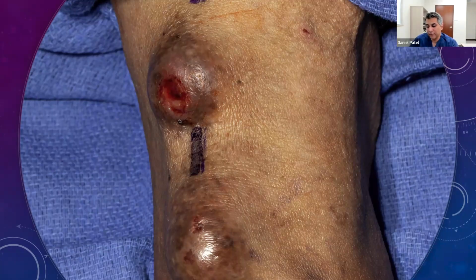We look for thinning of the skin. Can you pull skin up over that ulcer? If you can't, and it's very thin, that's when you really need to have that patient seen with your interventionalist or your surgeon to maybe consider a revision of it. And it's inevitable for many of these. After many years, we've got some fistulas at 10 years plus, and the skin does start to wear out.